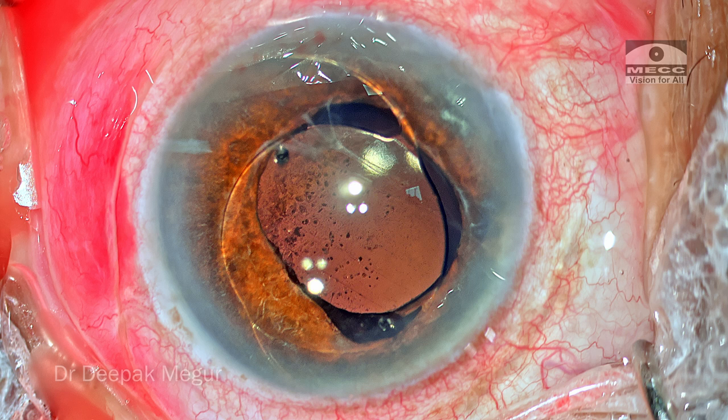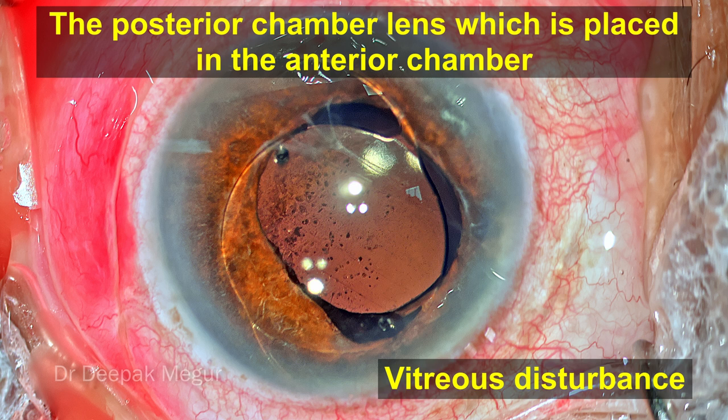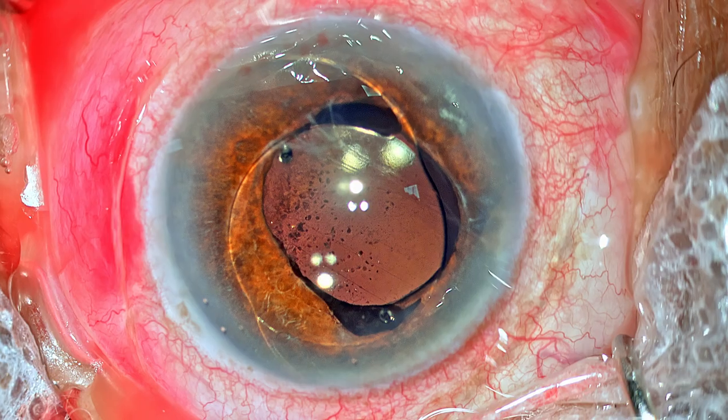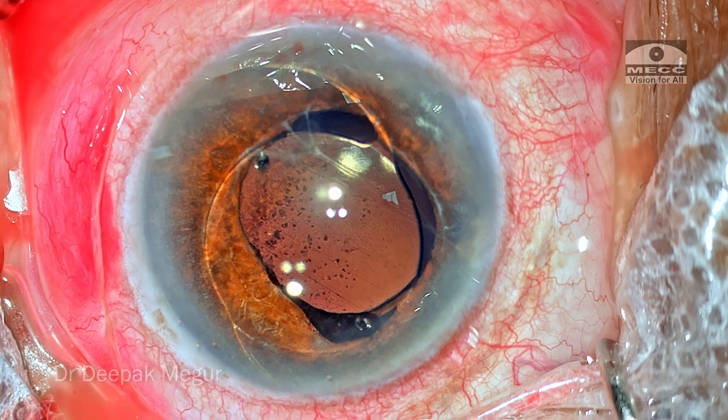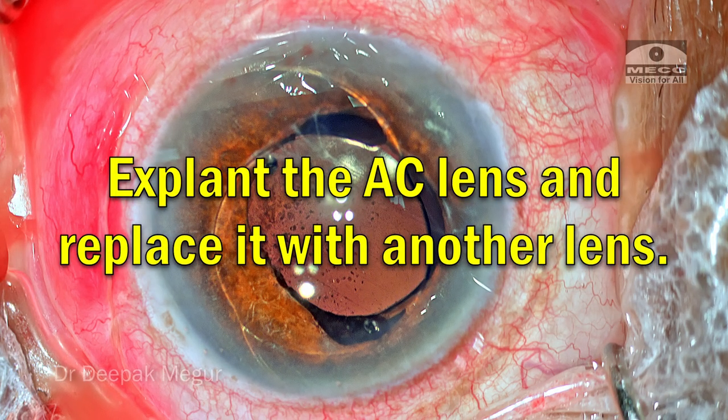The reasons are very obvious. This is a posterior chamber PMMA lens which has been placed in the anterior chamber, probably because there was a vitreous disturbance and the primary surgeon thought of placing this PC lens into the anterior chamber. So now we have a situation where it's almost a year or year and a half that the lens is stuck there. Obviously, we need to explant it and replace it with another lens.